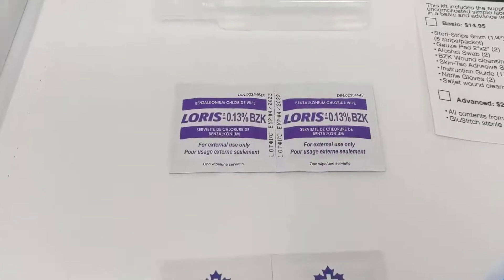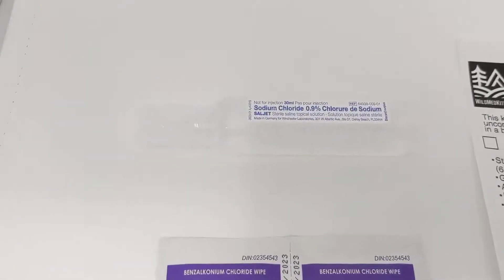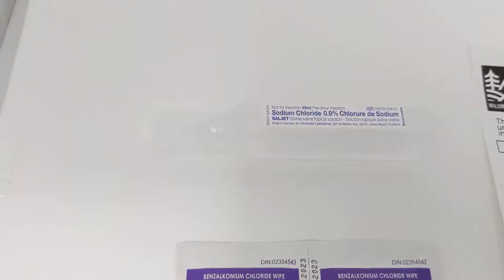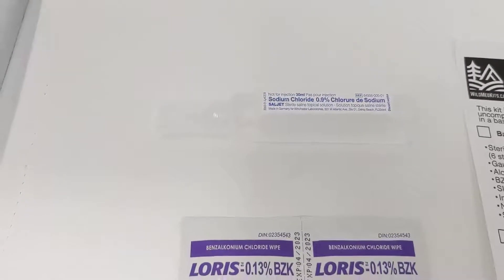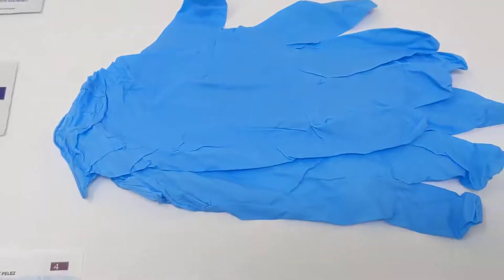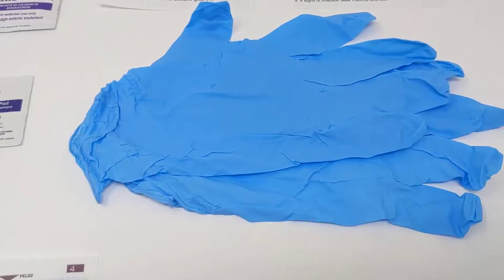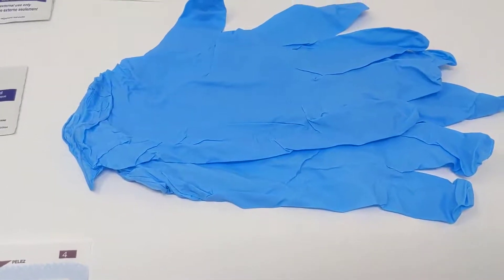You have some BZK swabs to clean out the wound, as well as a saline saljet bullet that has an irrigation tip on it — again to provide some high pressure irrigation and cleaning to that laceration before you close it. It's going to have a pair of nitrile gloves, really high quality, to keep yourself protected and keep your fingers from getting glued while you're doing this.